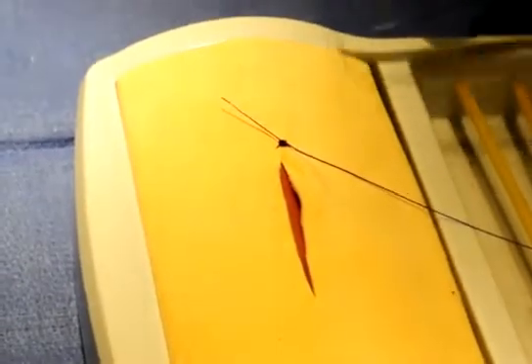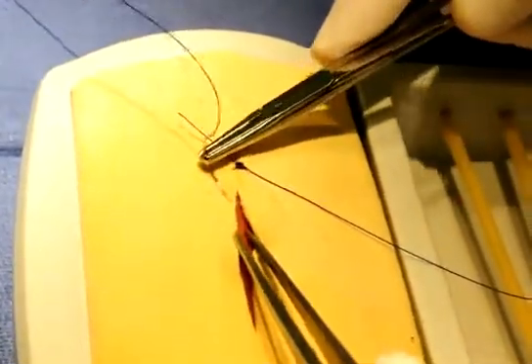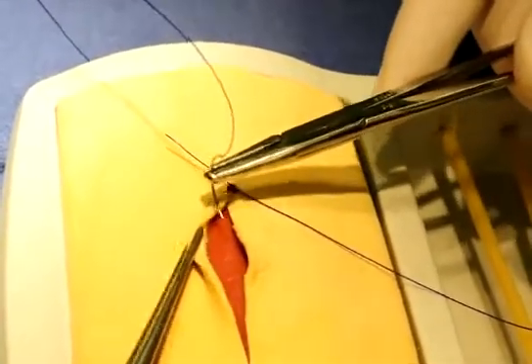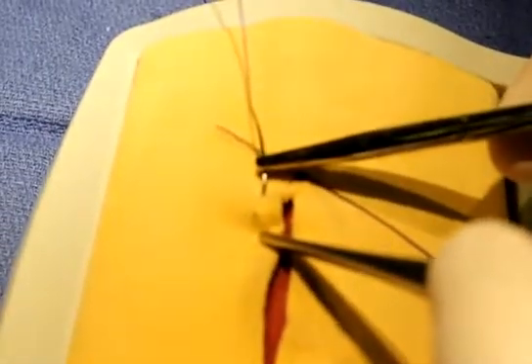like that. So the first one I'm going to show is the Cushing pattern, and imagine, if you will, that this would be the outer layer of the stomach. You know, this would be the serosa muscularis, and that way here on the inside is going to be the mucosa, and this is just the inside. Okay, so the bites for the Cushing are run in a direction that's parallel to the incision, and they do not enter. So I'm going to try to make this needle not penetrate all the way through.